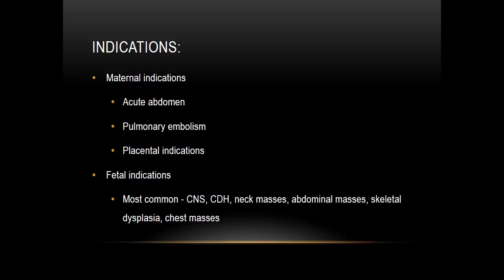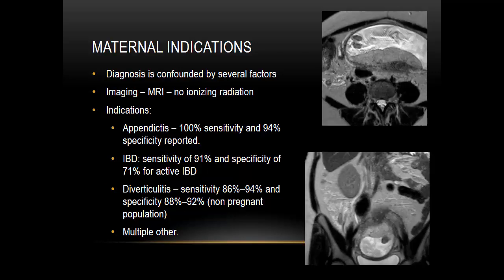So those are practical considerations to think about in short. Now, looking at some of the indications, we'll talk about the maternal and fetal indications restricted only to CNS.